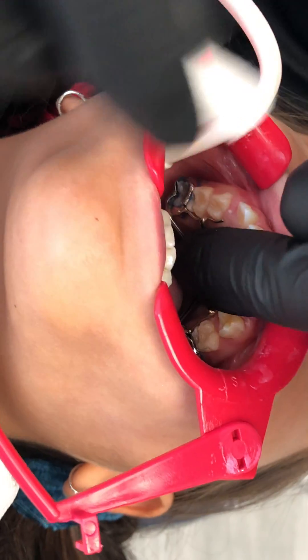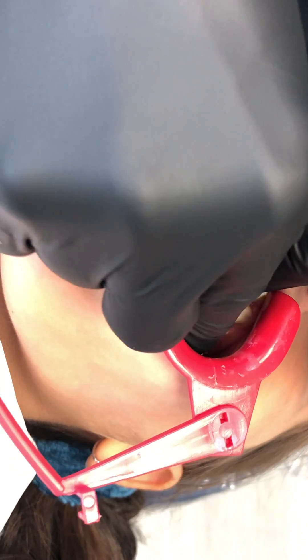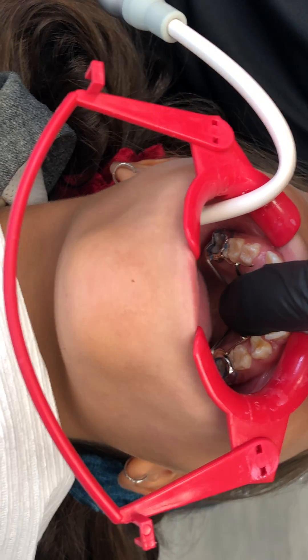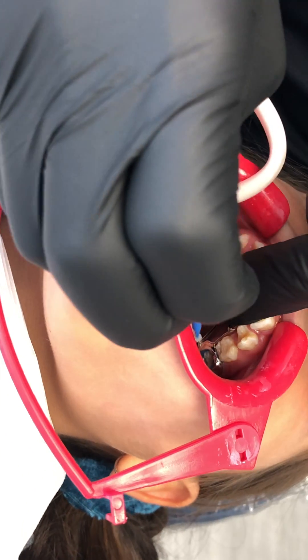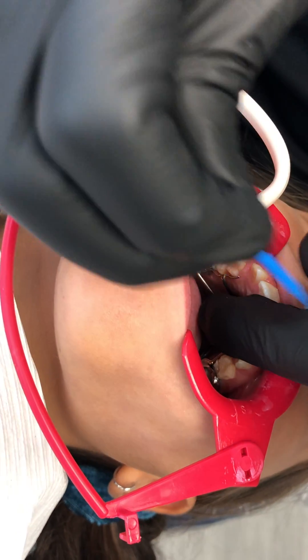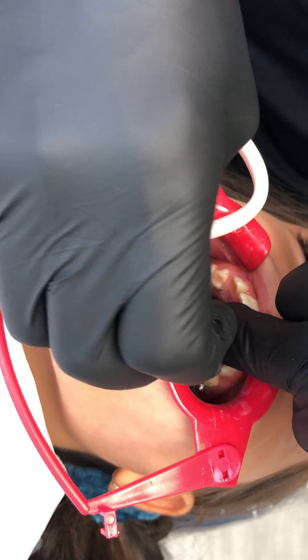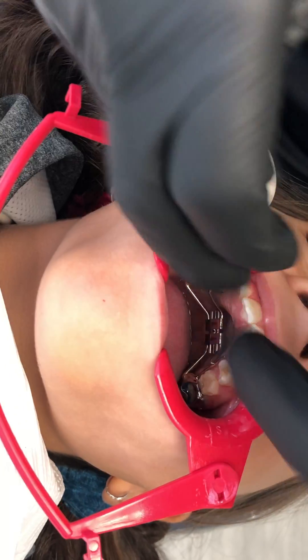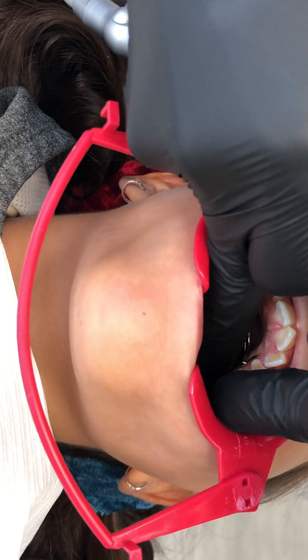We're going to wipe away the excess cement. With these appliances you tend to get more cement coming out from the lingual surface, so you don't want that getting stuck underneath the appliance. With a traditional expander you'd often get it coming out the occlusal, but in this case we tend to get more of it on the lingual at the gingival.